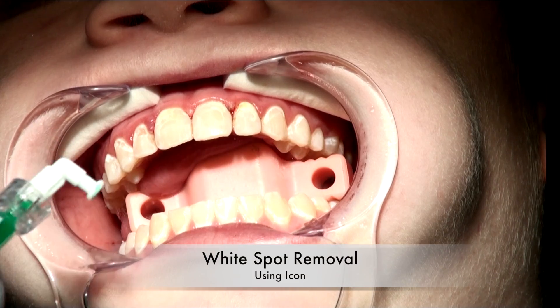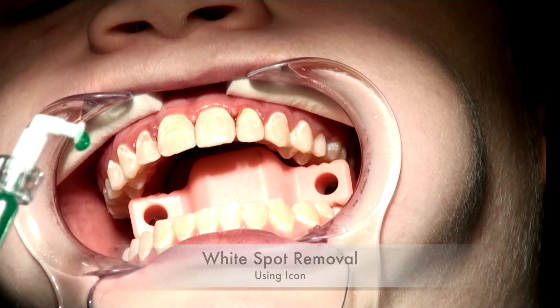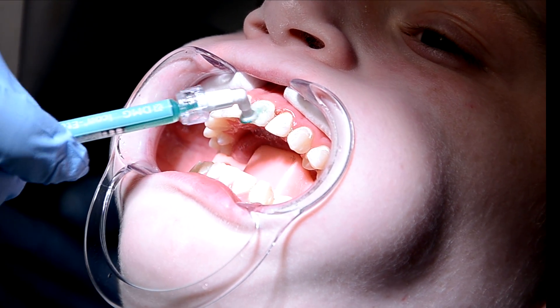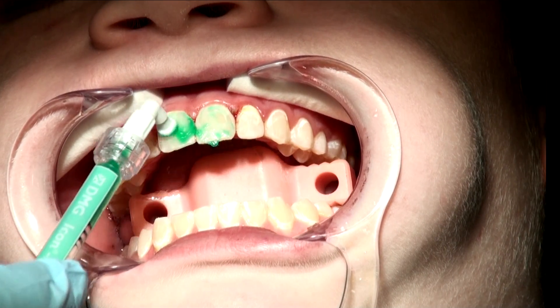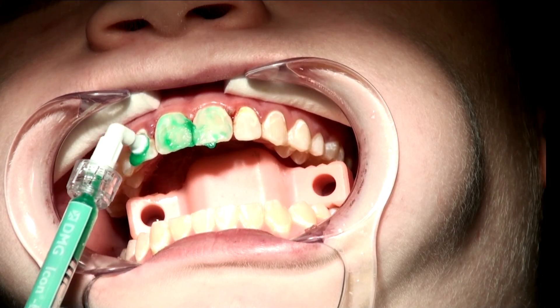This is the etch, and it's applied with a special applicator tip. As you turn it, it comes out the end, and you want to focus on applying it all throughout the area. Prior to doing this, Jason had a liquid dam placed around the gums, and everywhere we see a white spot, we're going to treat.